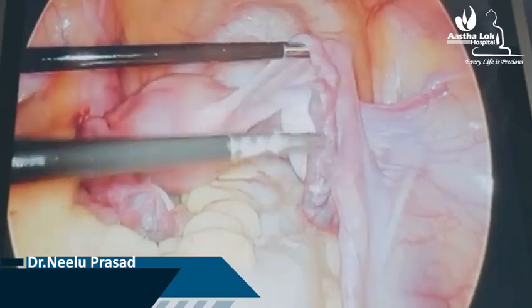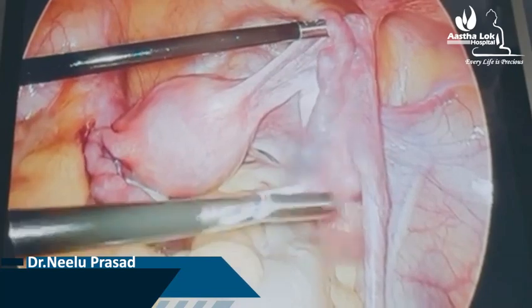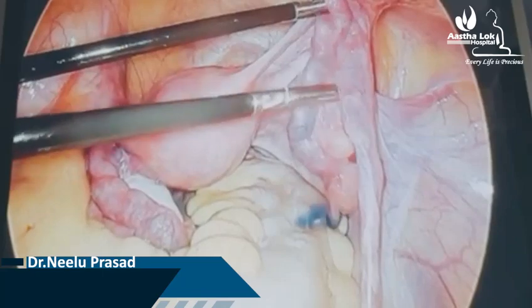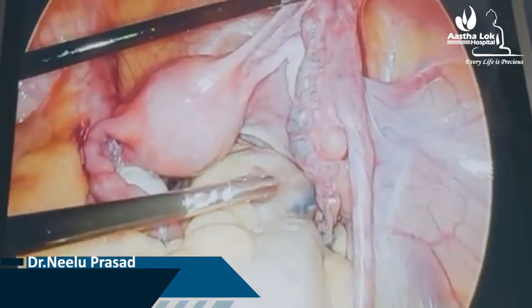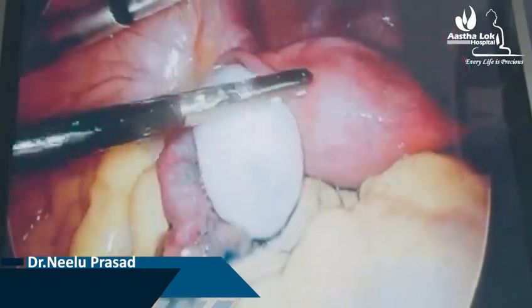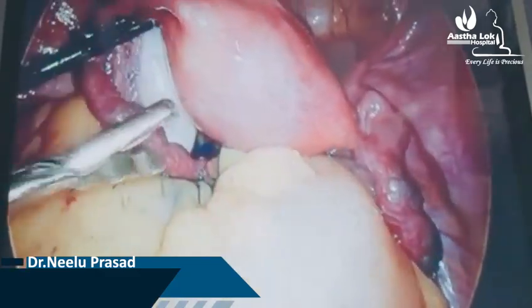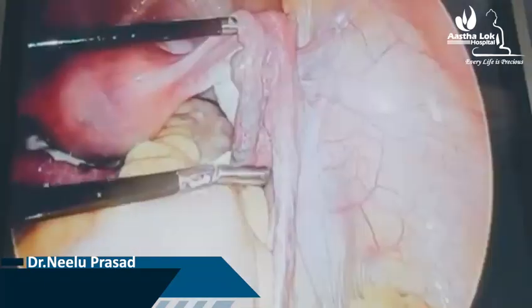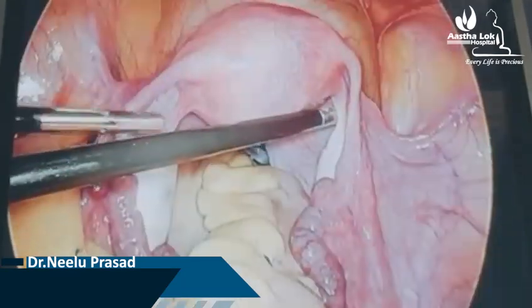Now the patient is under general anesthesia. We put the applicator, the grasper, into the pelvic cavity and the assistant pushes the dye into the uterus via the cervix. So this is an overview of the monitor picture, and in this case the dye is just spilling into the cavity. That means the patency is normal.